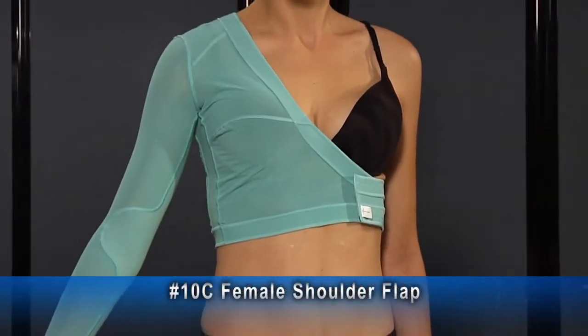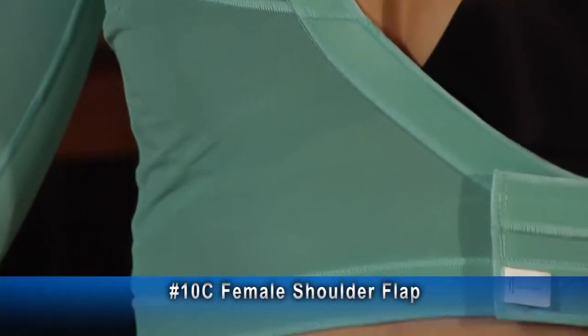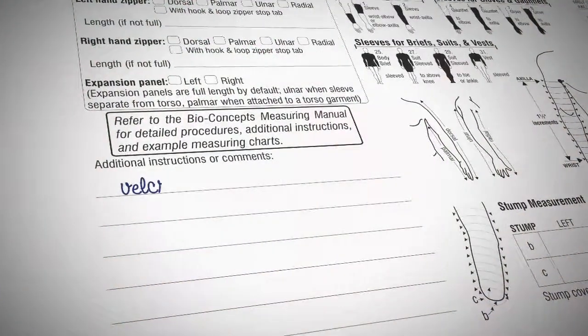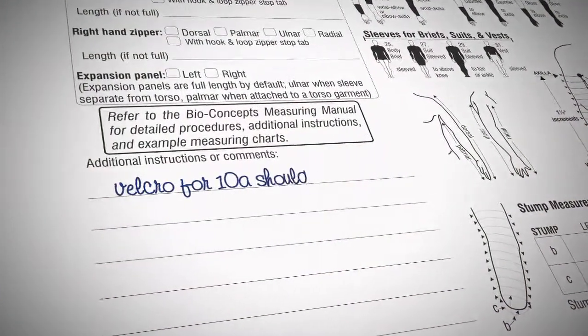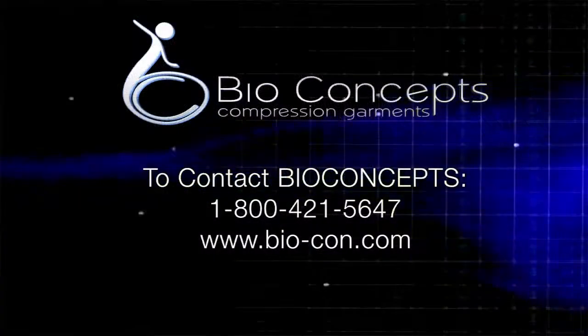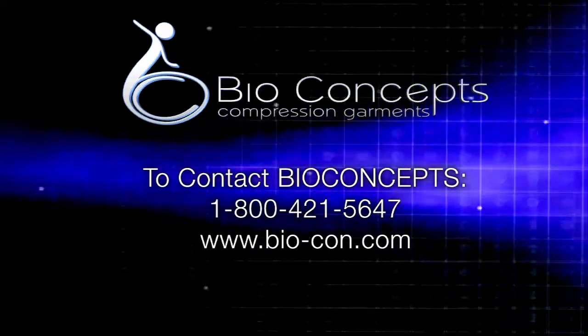This sleeve to axilla has a female shoulder flap, an adjustable velcro, and expansion panel extending down the side of the shoulder flap. If these or any other options are desired, they must be specified on the measurement chart.